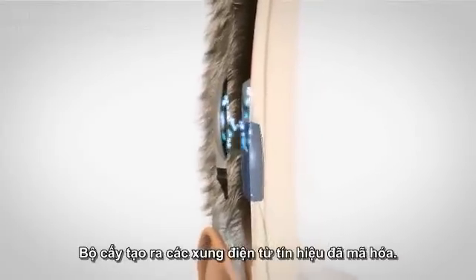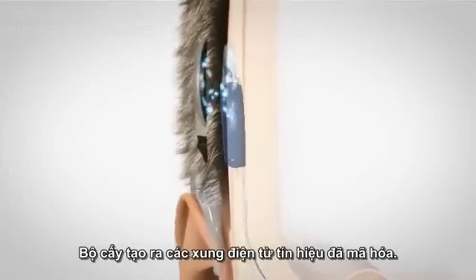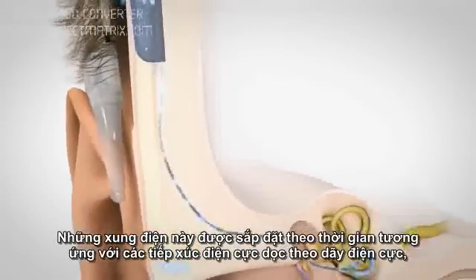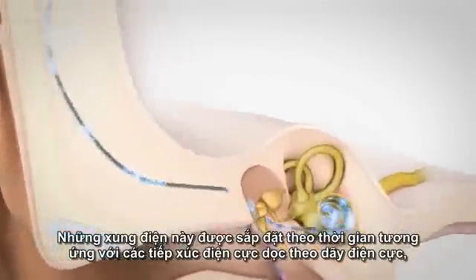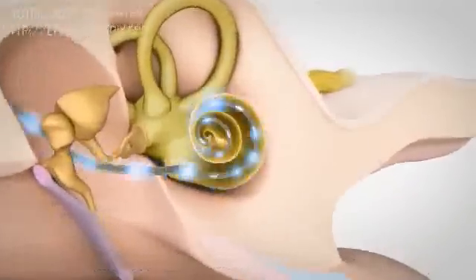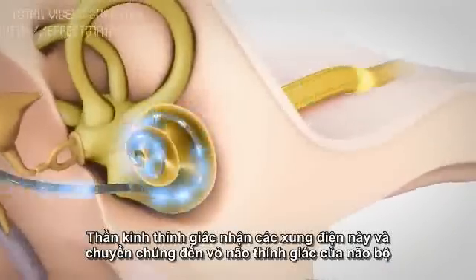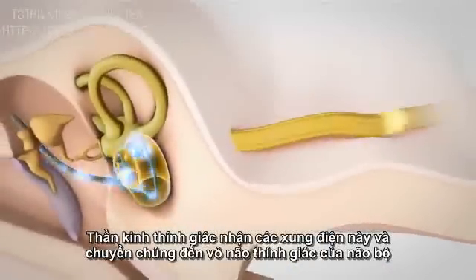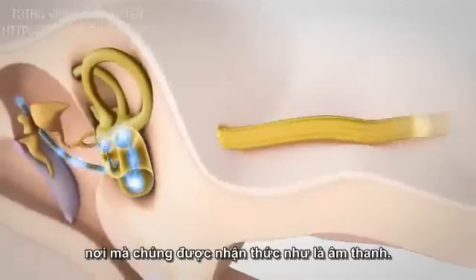The implant creates electrical pulses from the coded signals. These pulses are relayed to the corresponding electrode contacts along the electrode array, depending upon the frequency of the signal received. The hearing nerve receives these pulses and transfers them to the auditory cortex of the brain, where they are perceived as sound.